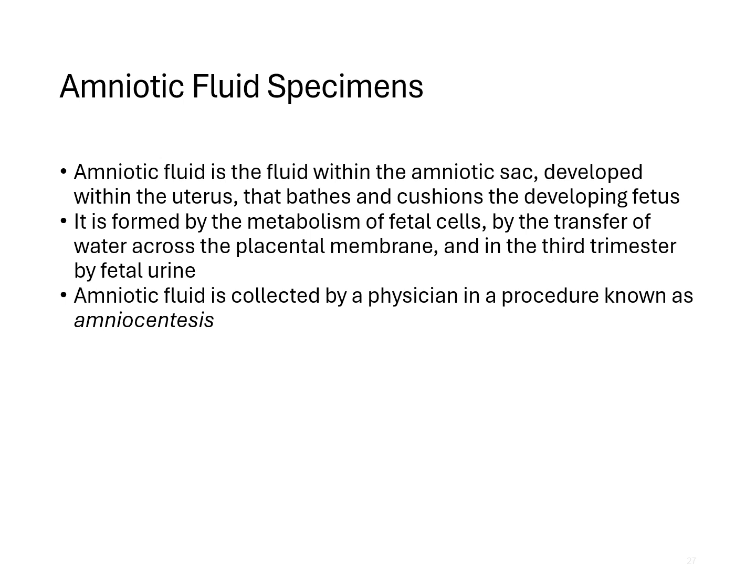The amniotic fluid is removed by a needle that is inserted through the mother's abdominal wall into the amniotic sac. The fluid is transferred into a sterile container, protected from light, and is immediately transported to the lab for analysis. Again, phlebotomists would never be collecting this sample, but they may be in charge of bringing it back to the lab or transporting and processing it for testing.